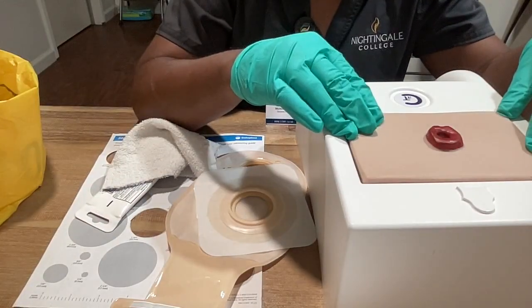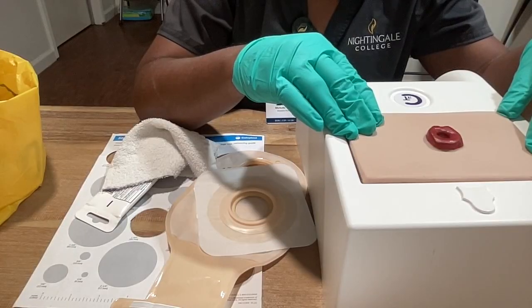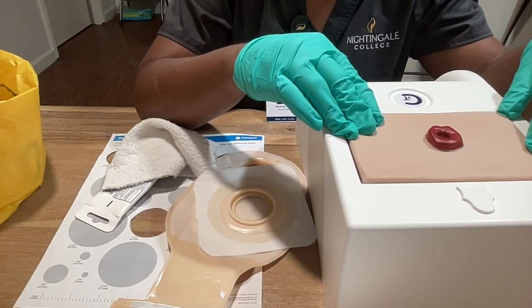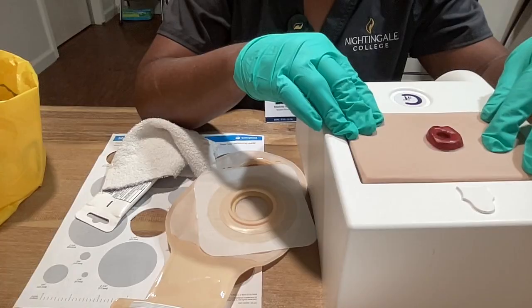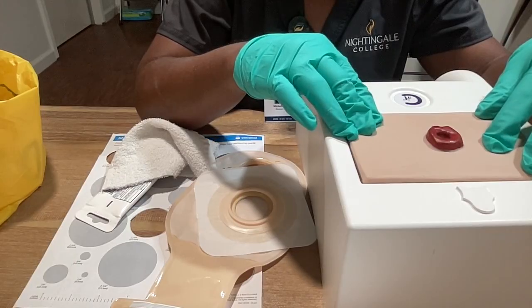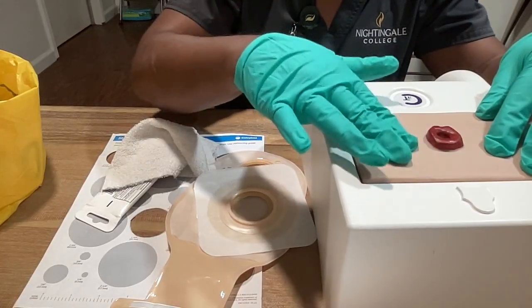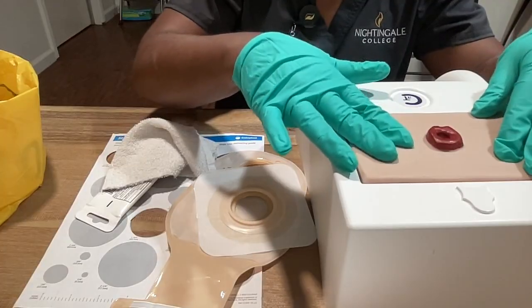Now I want to assess it. I want to make sure that the stoma is beefy red. If it was blue or purple, I would notify the provider immediately. I just want to check the skin around to make sure that there are no signs of infection. I would be looking for any redness, swelling, or if the area is warm. Ms. Jones, while I'm touching, are you experiencing any pain? Perfect.